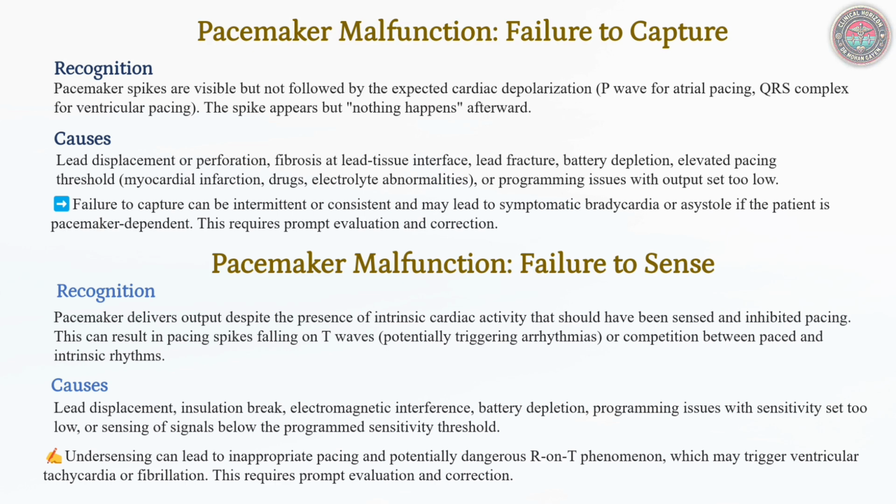Causes include lead malposition, insulation defects, electromagnetic interference, or inappropriate sensitivity settings. This malfunction requires urgent reprogramming or hardware evaluation to prevent complications.